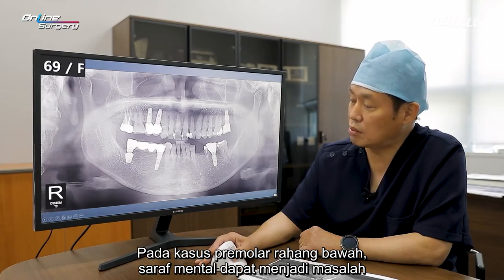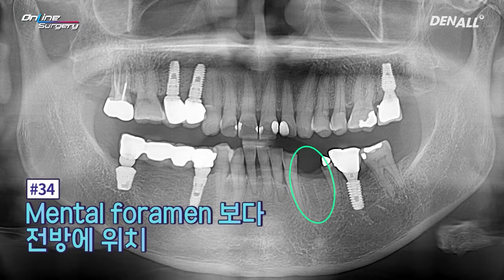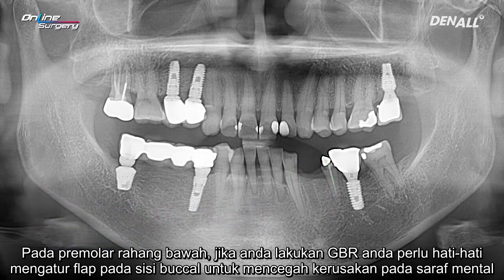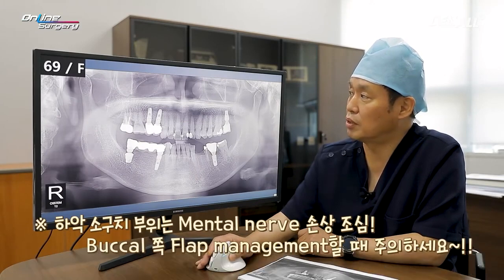In the case of lower premolar, the mental nerve can be a problem. Number 34 is slightly mesial to the mental foramen. In the lower premolar, if you do GBR, you need to be careful about managing the flap on the buccal side to prevent damage to the mental nerve.